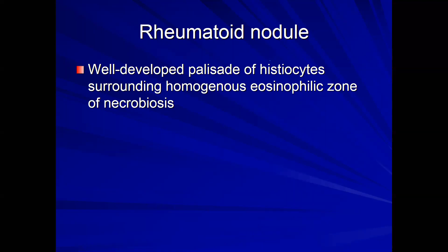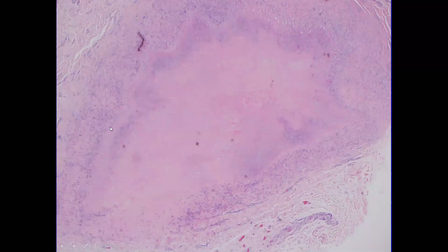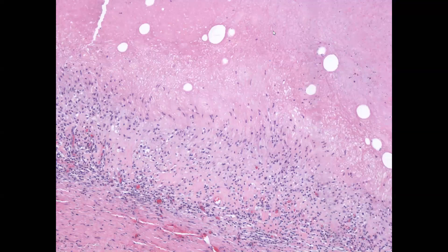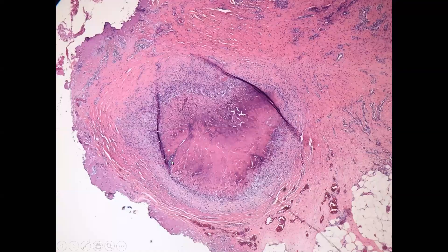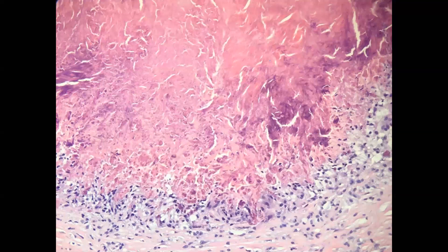Round versus horizontal is not a strict criterion. A rheumatoid nodule, on the other hand, is like a caricature of a palisade — very well developed. If granuloma annulare is an abstract painting of a palisade, a rheumatoid nodule is a cartoon: a perfect palisade of histiocytes around a very, very homogeneous pink zone of necrobiosis. Here is a rheumatoid nodule with the palisade of histiocytes and homogeneous pink material — and it should remind you of the lupus miliaris case.